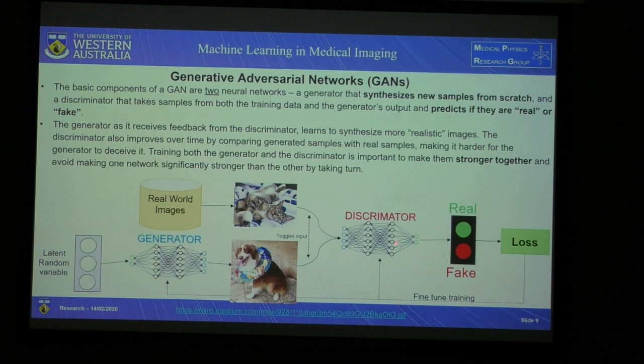The discriminator will then recognize this as being a fake image and will, in the form of what we call loss, give the generator feedback on how it can create a better looking image to what we desire, such as the image here.